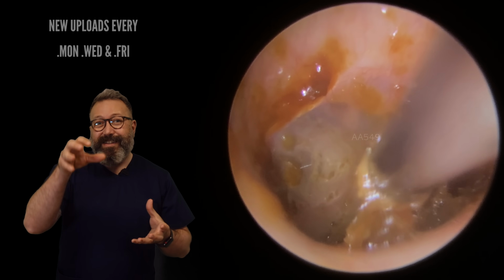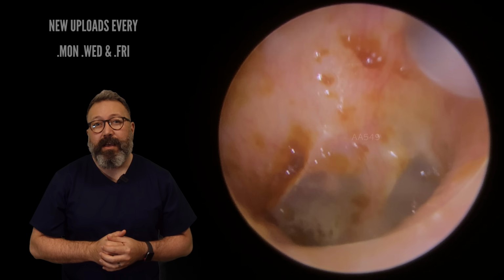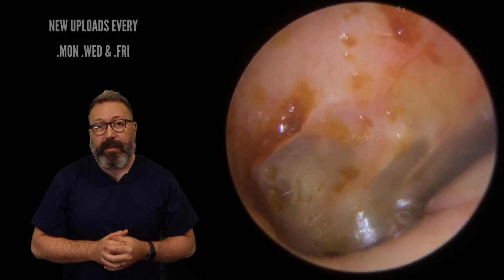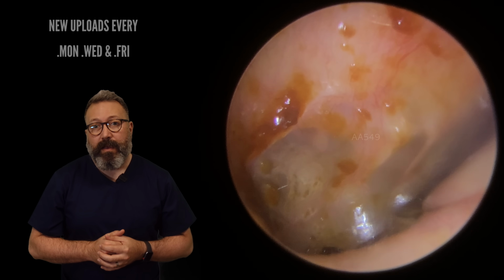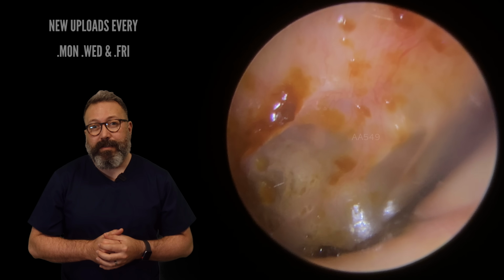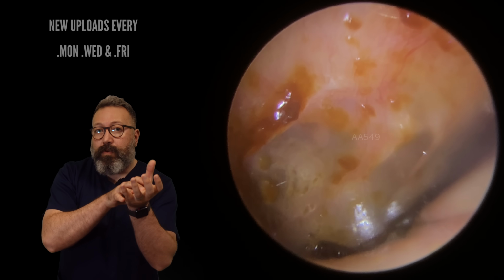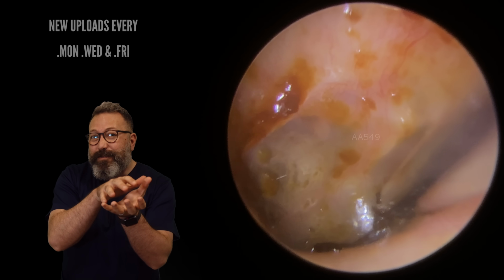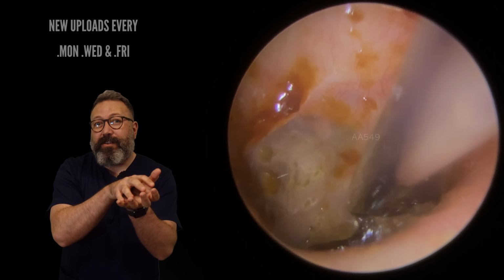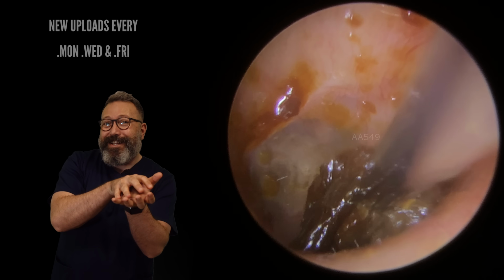We've already taken a lot from down there, but there is so much hiding down in that recess. Oh, I can just see a little bit more. Now, it doesn't appear like there's a lot down in there now. Oh, nearly. I'm trying to avoid the eardrum, the canal wall here. Look at this. As it comes away, watch this. So look at it. On first glance, it doesn't look like anything. Well, look at that chunky bit that was sitting down in there.